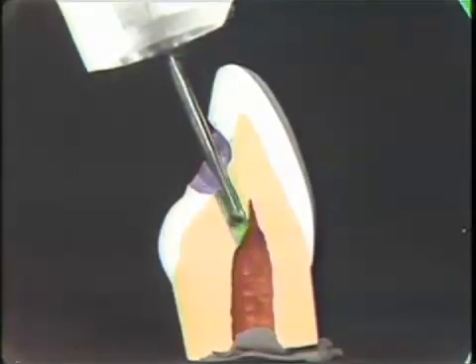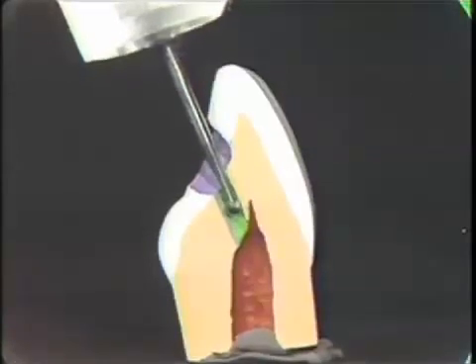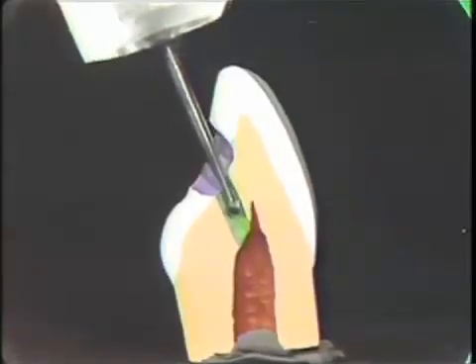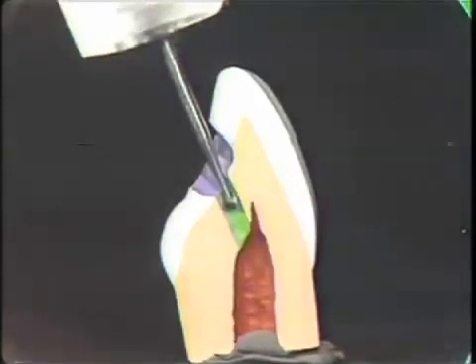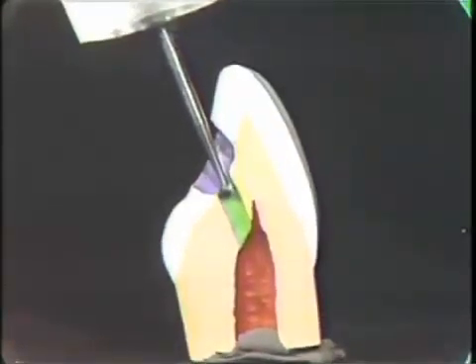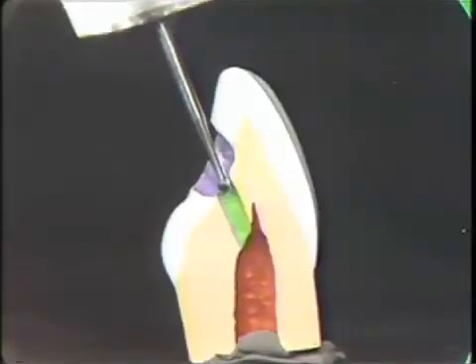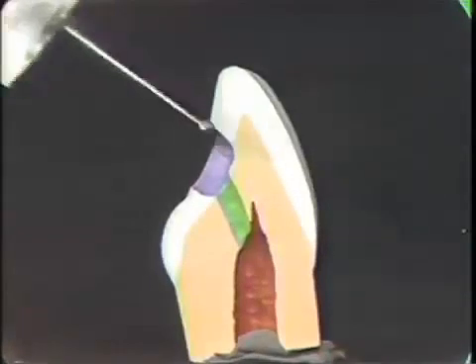Now, if you have the proper angulation in this step, it's almost impossible to miss the pulp chamber. You have to keep the head of the handpiece tucked over the incisal edge of the tooth. Now, there are two ways where people get in trouble in this step. One is to start off in the wrong angulation.